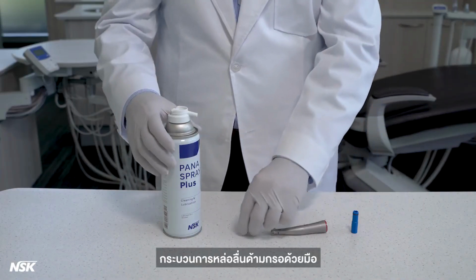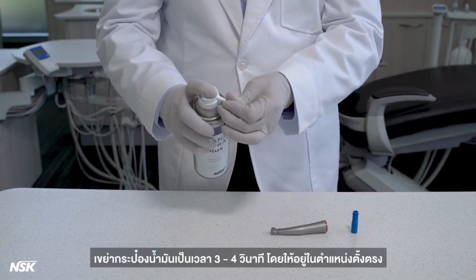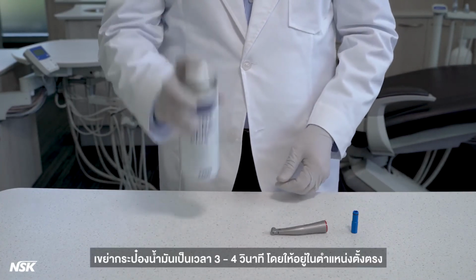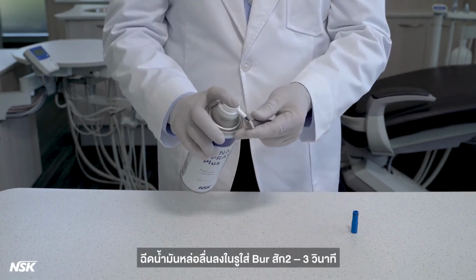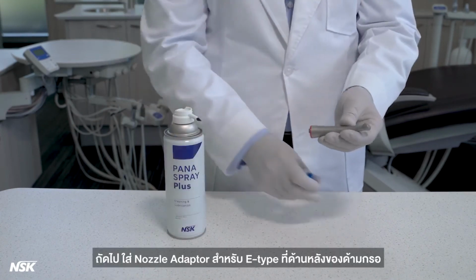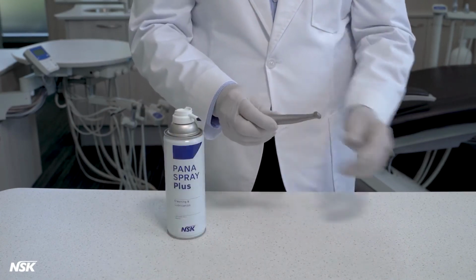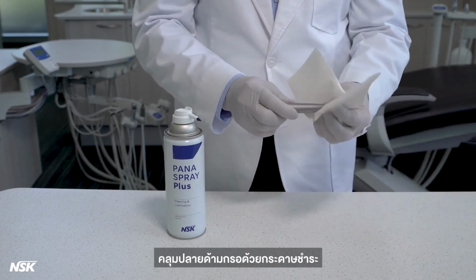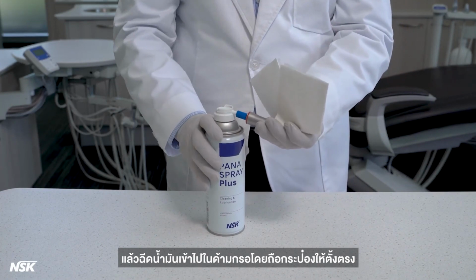Manual lubrication process. Insert the spear-shaped nozzle. Shake the oil can for 3 to 4 seconds, keeping it in an upright position. Spray lubricant into the burr insertion hole for a couple of seconds. Next, insert the E-type nozzle adapter to the back of the attachment. Cover the head of the attachment with a paper towel and spray the oil into the attachment while holding the can in an upright position.